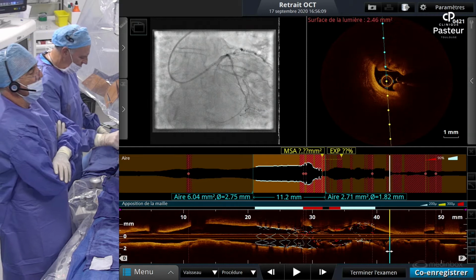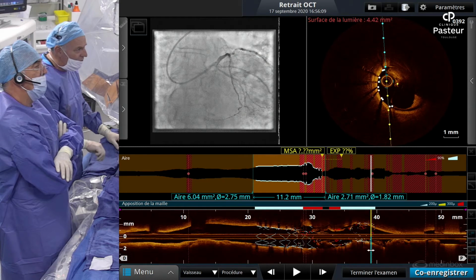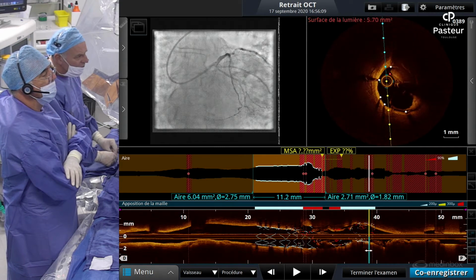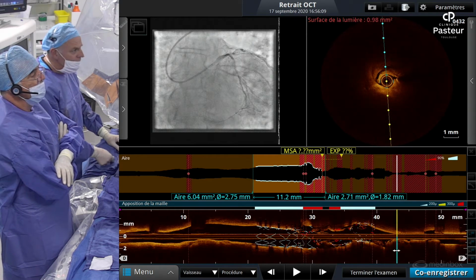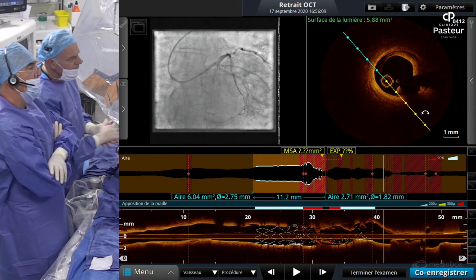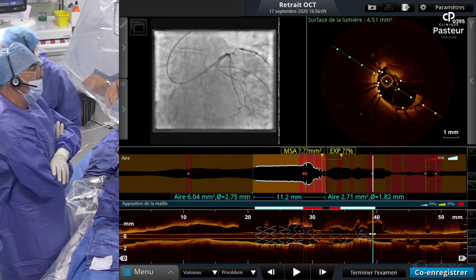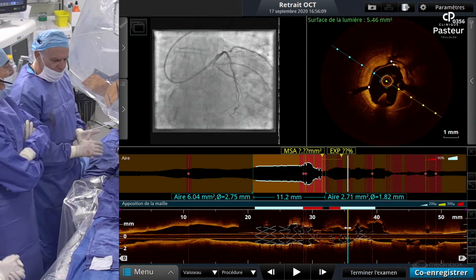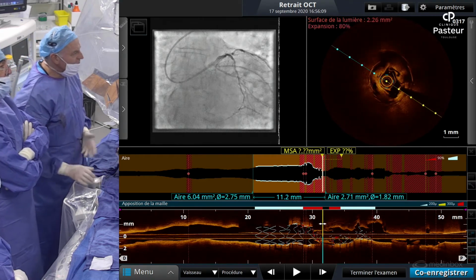So here I will say that we have to put an additional stent at the level of the left main. This is the origin of the stent. Can we see the bifurcation with the circumflex? Pull back. It is here, I think. So now the strategy is to treat the left main. It should certainly be from close to the ostium to the other stent. It's better.